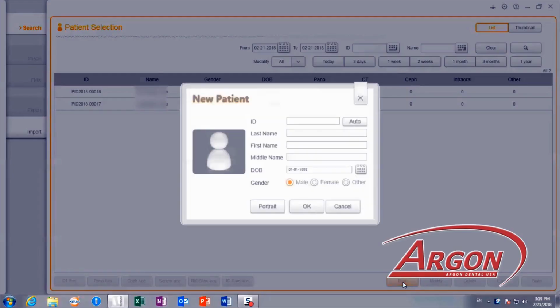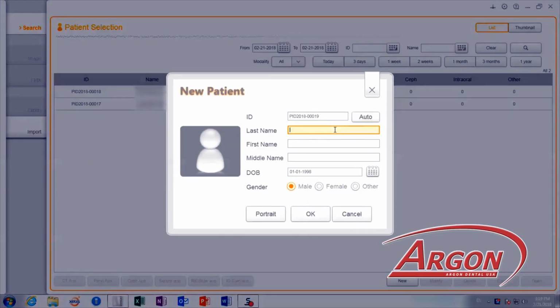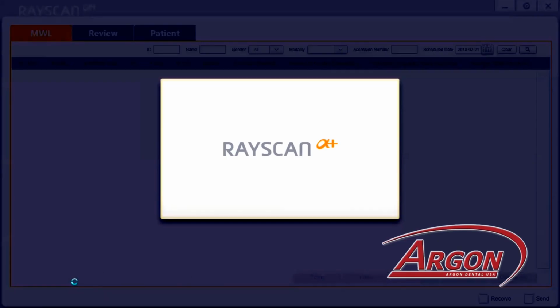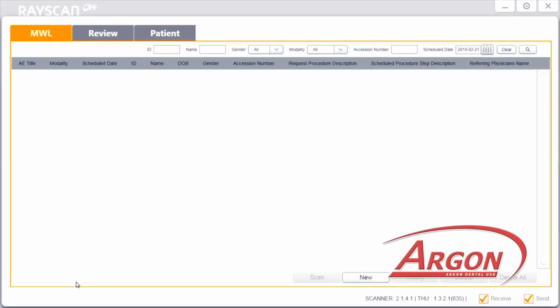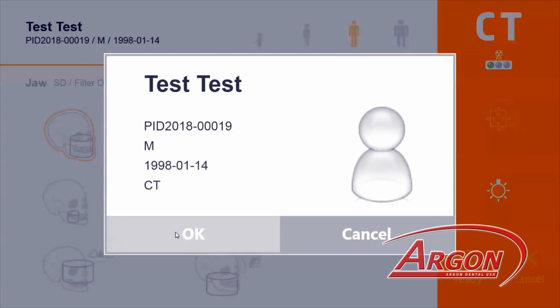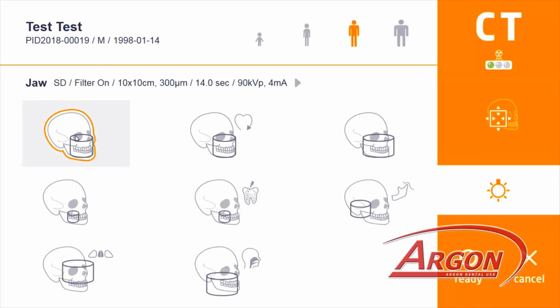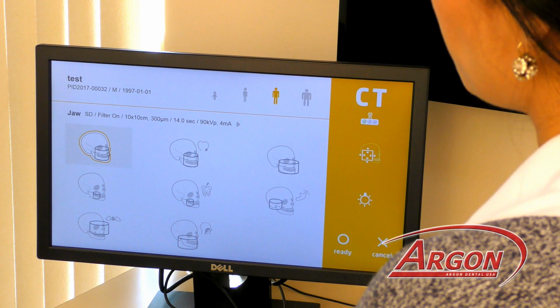Now you would go to the software and set up the patient's information. Choosing a CT scan. Make sure you read your manual depending on what CT scanner you have. We are using an Alpha Plus 130.